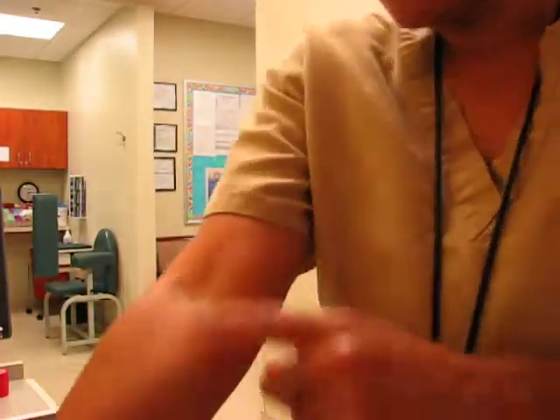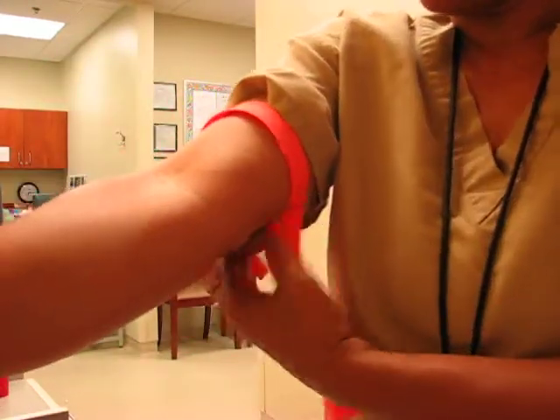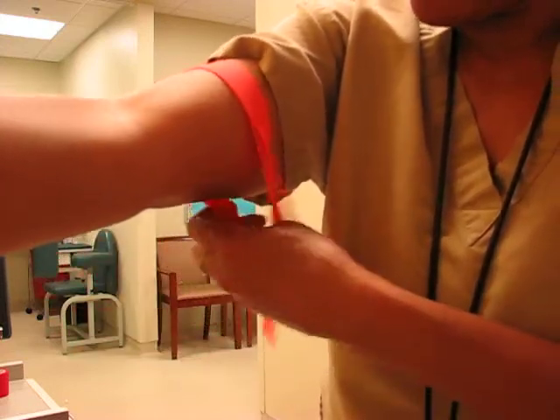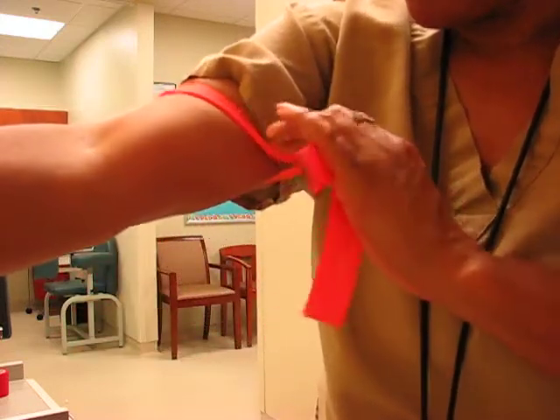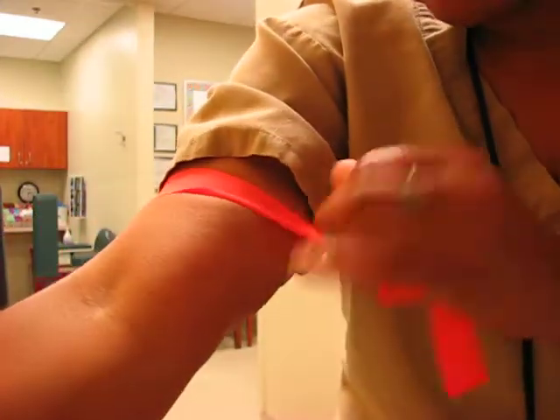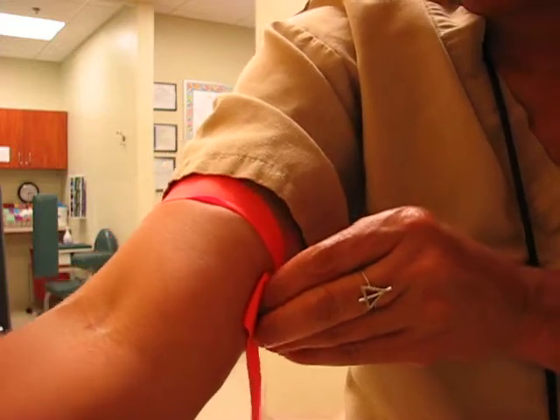However, everybody doesn't look like this or feel like this, right? And I think this is what you guys have been asking. I know a colleague, Clarissa — you guys met her. If she's here later today or sometime this week, I'm going to try to get with her, because I don't think her veins are as prominent as mine.